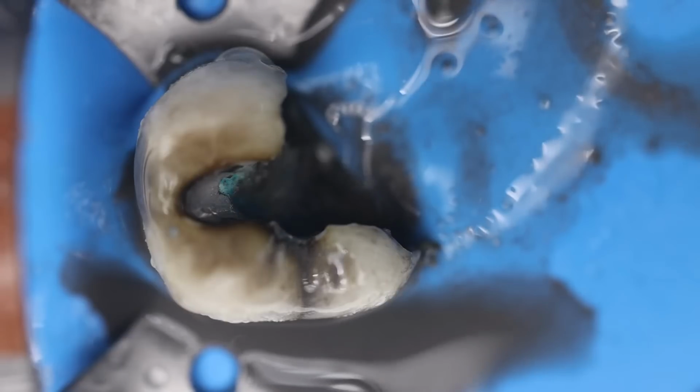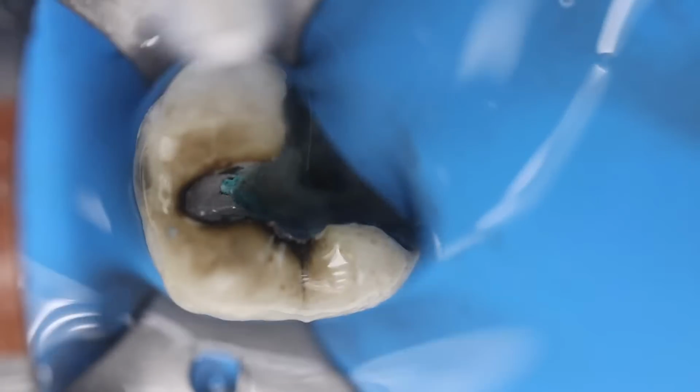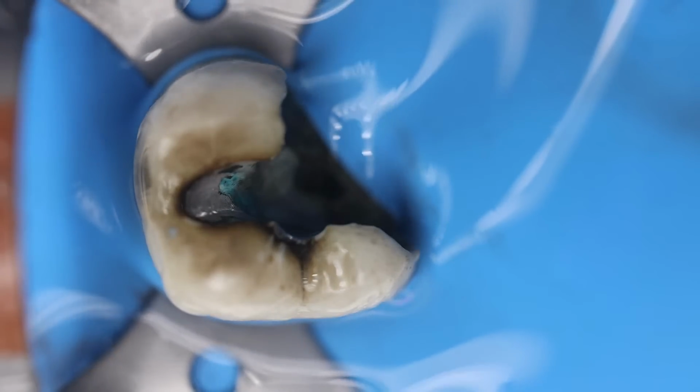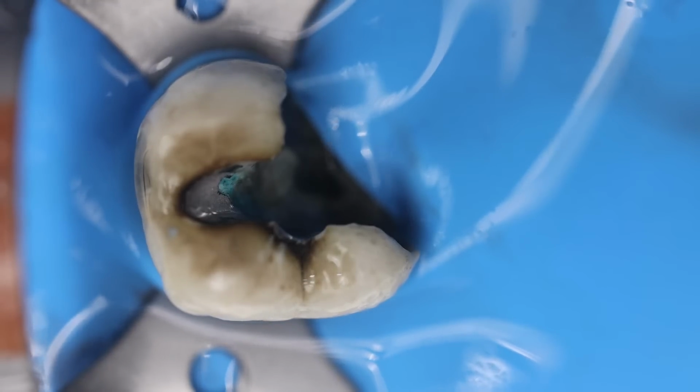Do not just penetrate deep inside. Just try to remove the dislodged restoration that is there, and have that clear field of view. Okay, we are going very slowly so that we can understand it easily.